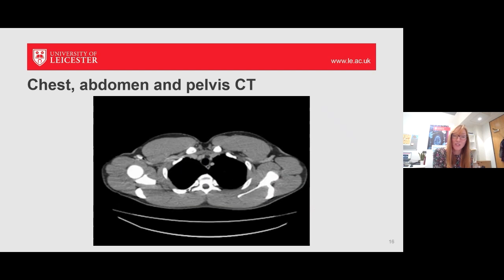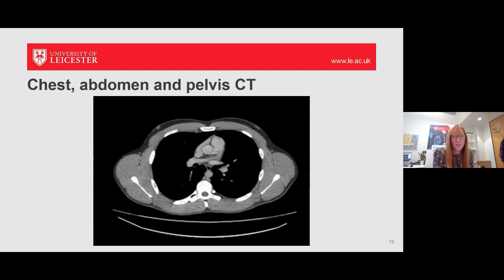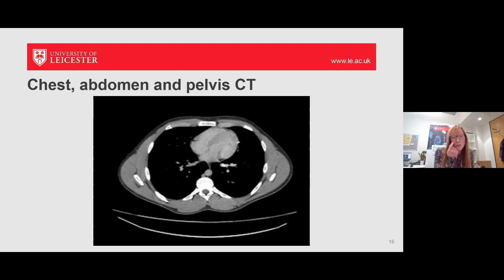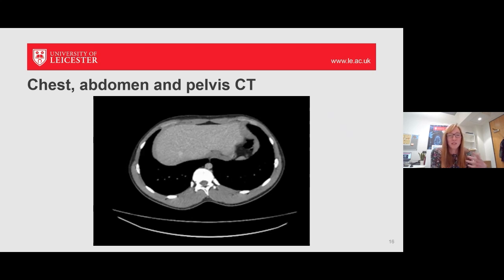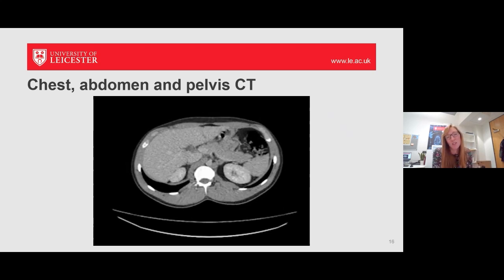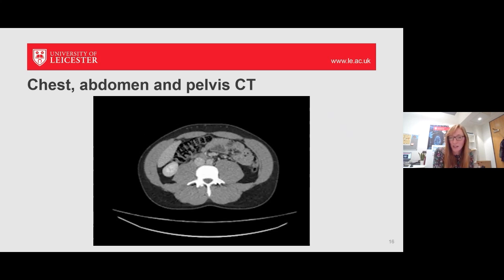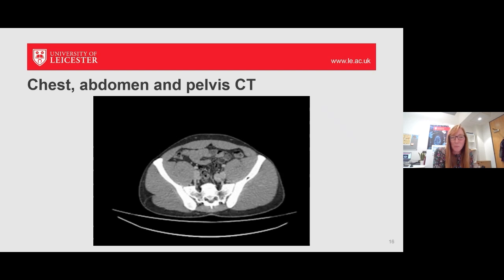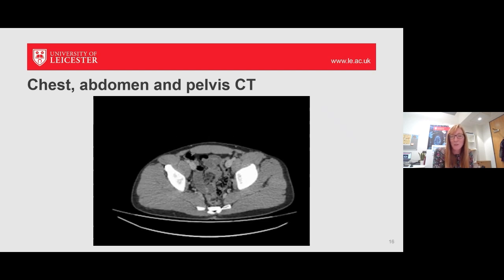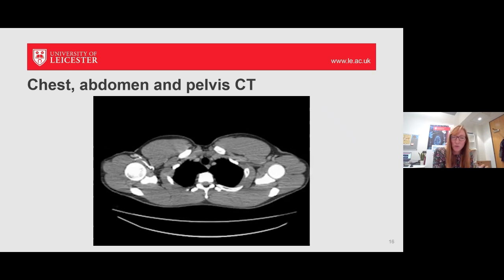So this is just a demonstration of a CT scan. As radiographers, we're going to learn how to interpret these images. The scan here is just running down the body. It's just gone through the lungs, coming through the abdominal area here, and there's various different soft tissue structures. Probably doesn't make a lot of sense to you at the moment. The great white bits are the bones. It's going to run through it again.